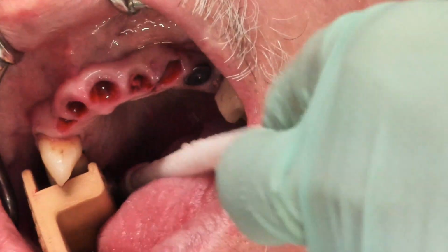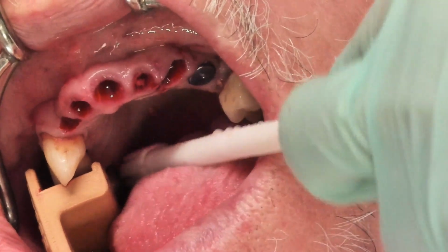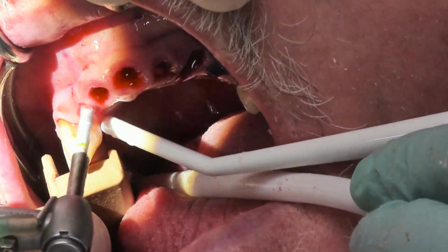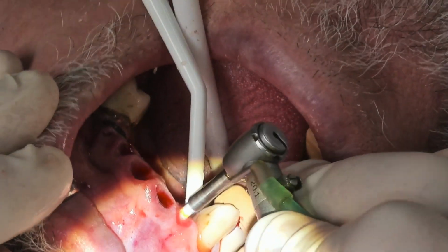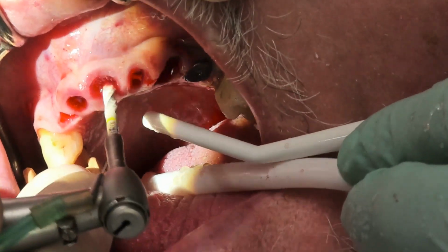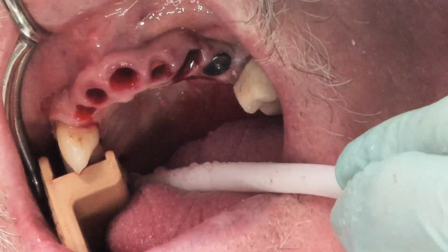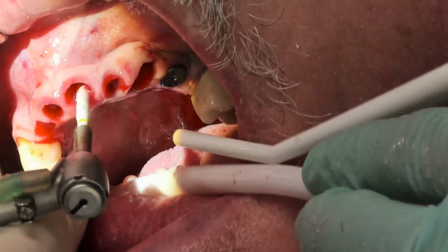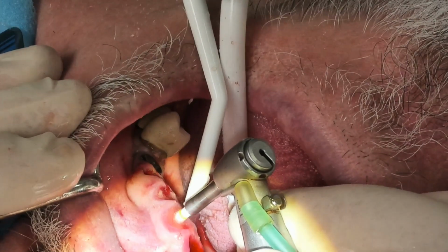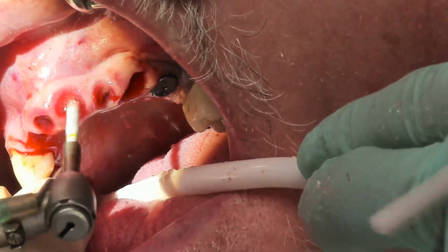Okay. So I'm just continuing to increase the diameter of the site. This is a 2.8 diameter drill. We're going to the top line, which is 12, which we'll do in hands-on later. So we're just widening the site as usual. Suction on top of you, front on the facial. Good.